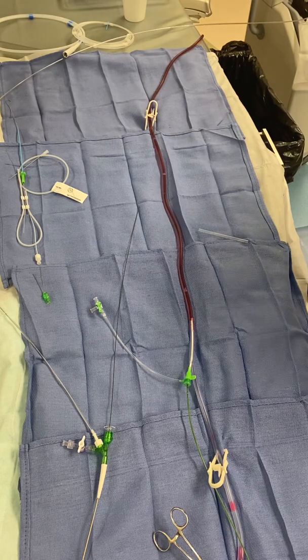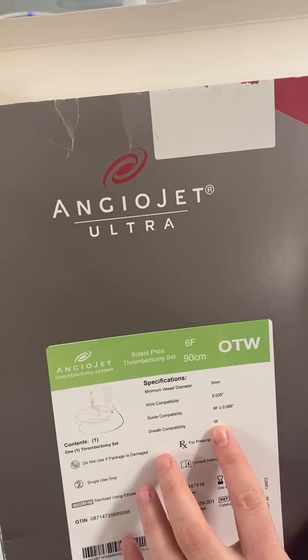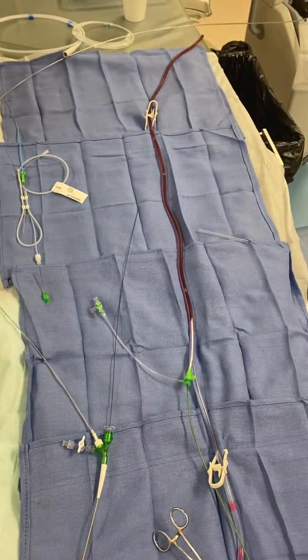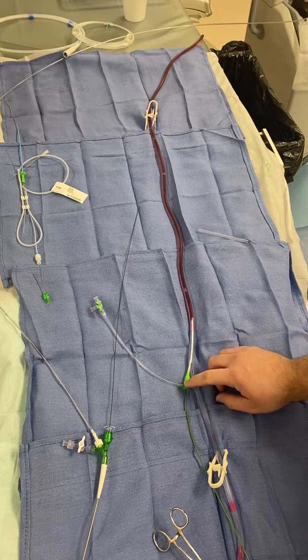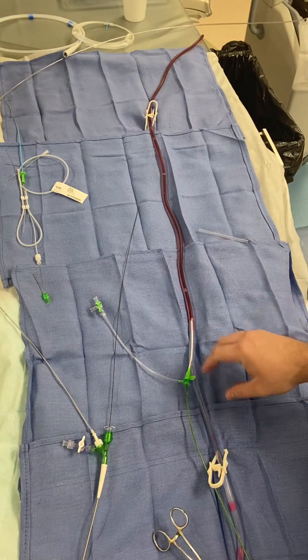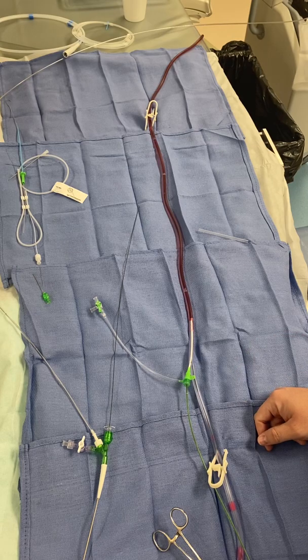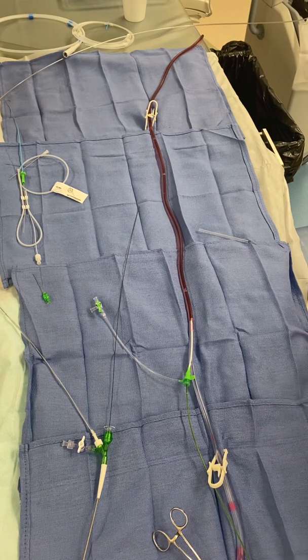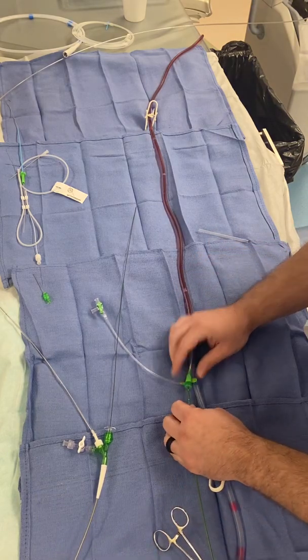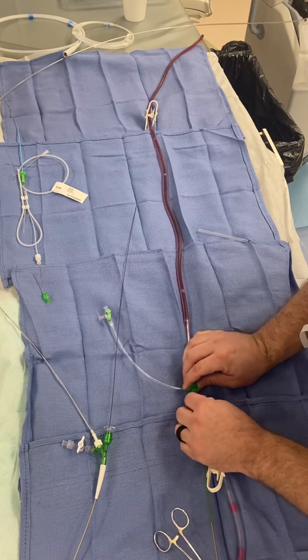They have their own rules on what the catheter fits through regarding sheath compatibility. This one gets through a six French. If you're using a guide, it has to get through an eight French. When it comes to coronary ones, it's monorail — so you have your catheter and an 0.014 wire beside it. It will not fit through a six French; you have to come down two sizes, especially going through a guide. For coronary I'd probably be using a four French.